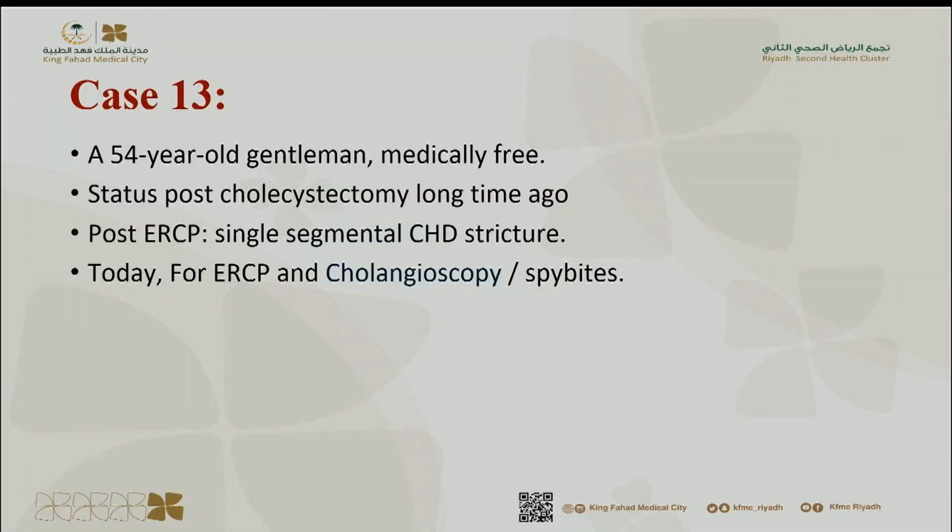A 54-year-old gentleman, status post-cholecystectomy a long time ago, post-ERCP with a single segmental common hepatic duct stricture. Today, planned for ERCP and cholangioscopy with SpyBite.